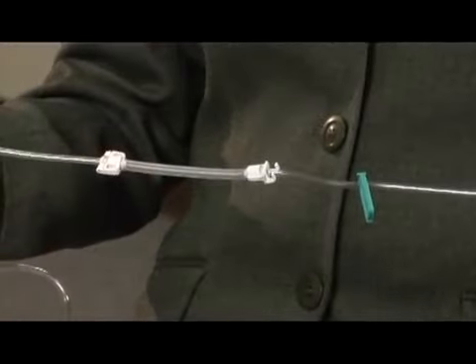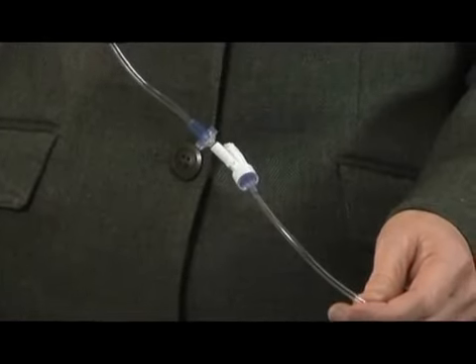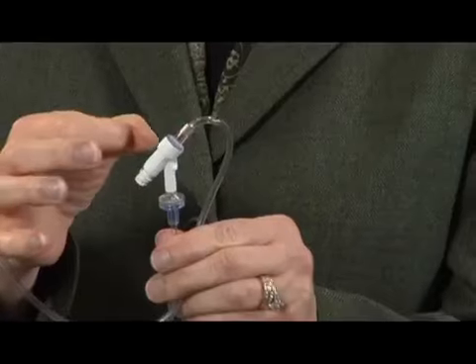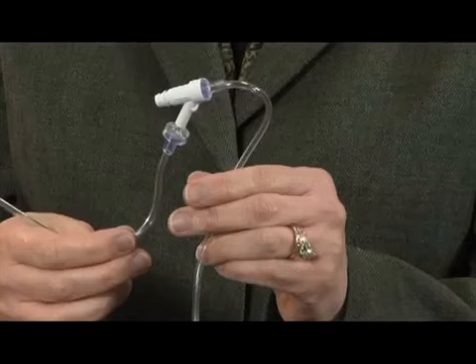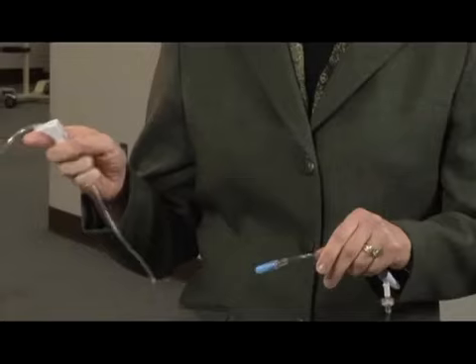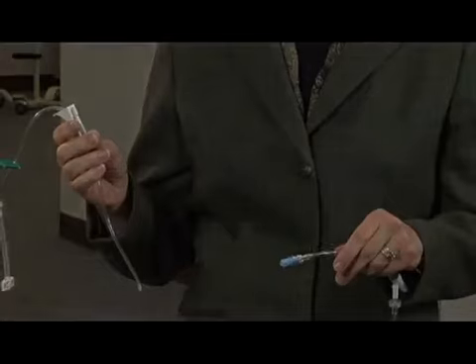Fill the drip chamber to two-thirds full. It is important not to twist or stretch the silicone segment. Slowly prime the tubing. When the fluid reaches the first injection site, stop the flow. Invert the injection site and gently tap it to remove any trapped air. Continue slowly priming and repeat at each injection site. Close the roller clamp once primed through to the distal end of the set. Do not reopen the clamp until the pump prompts you.